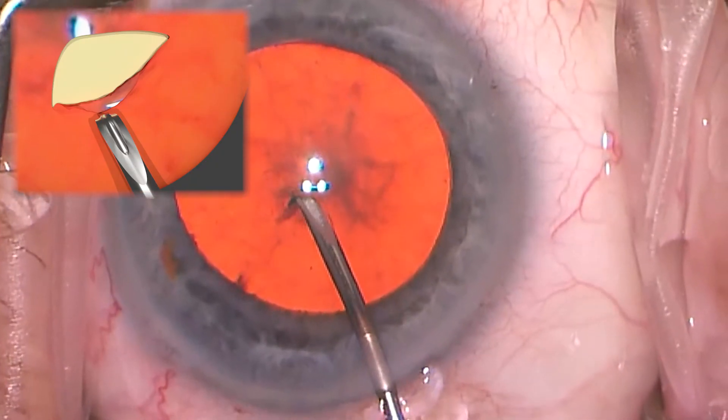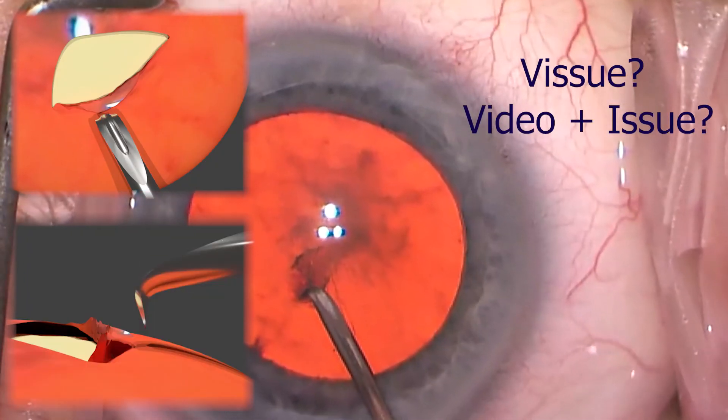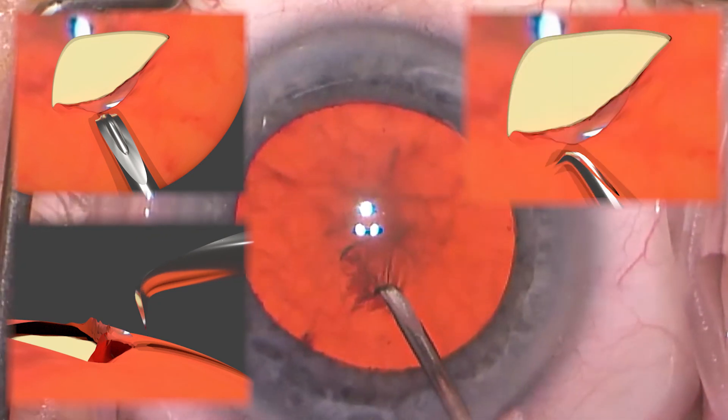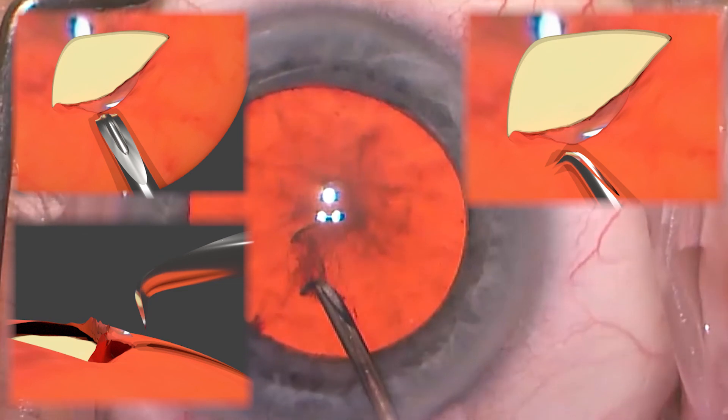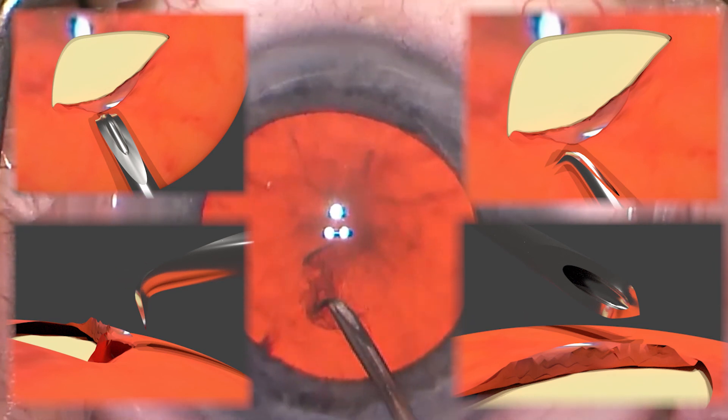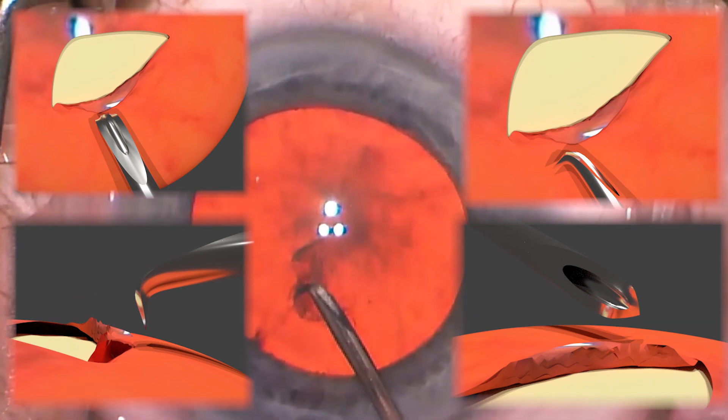Let's look one more time at this segment where there were troubles, with the overlying images showing why there really were these problems. I would suggest you stare at this, or pause it, or rewind it — maybe even go back to a section where these images are not superimposed so you can really understand what the issues are here.